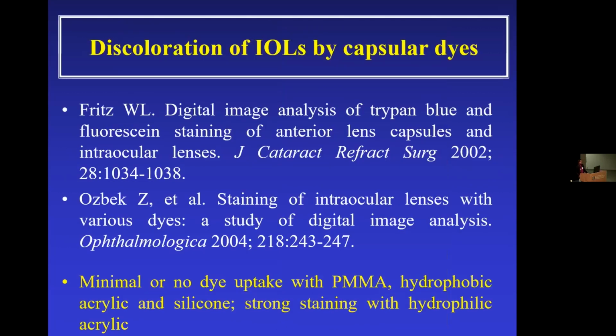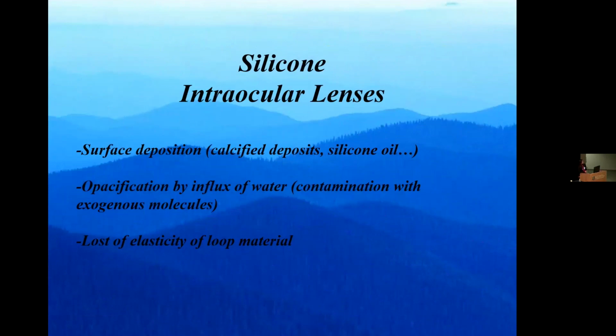Based on that study, different groups started to evaluate the interaction between capsular dyes and intraocular lenses, and they found that there is usually minimal or no uptake of dye with PMMA, hydrophobic acrylic, and silicone lenses, but there is interaction with hydrophilic acrylic lenses. However, the majority of those lenses are already implanted in the hydrated state, therefore you do not hear about this type of problem. Let us move on with problems related to silicone lenses.